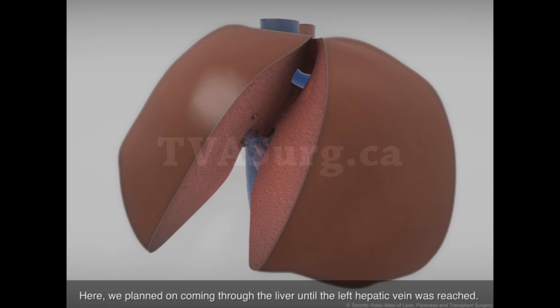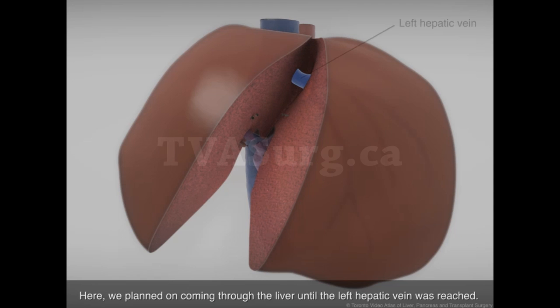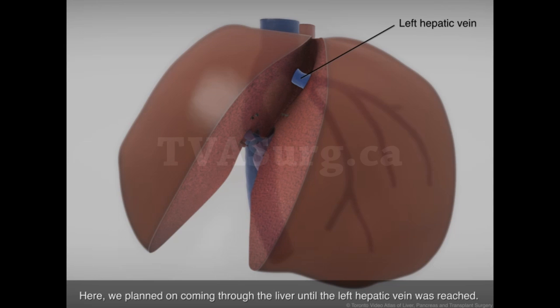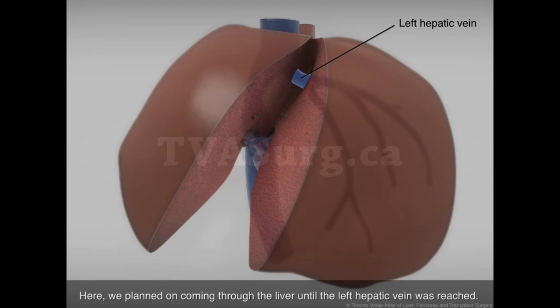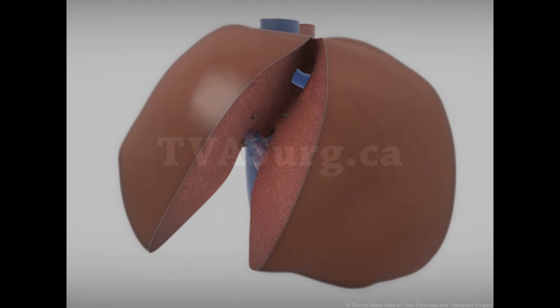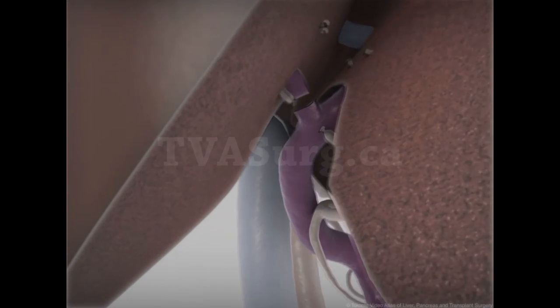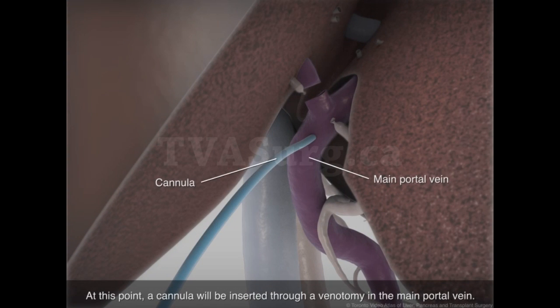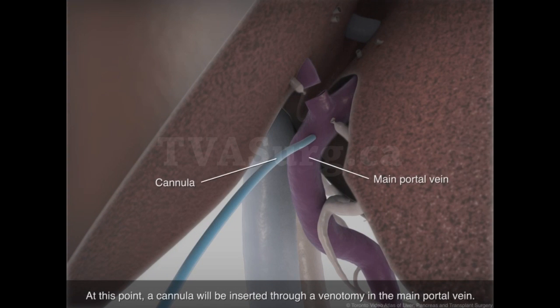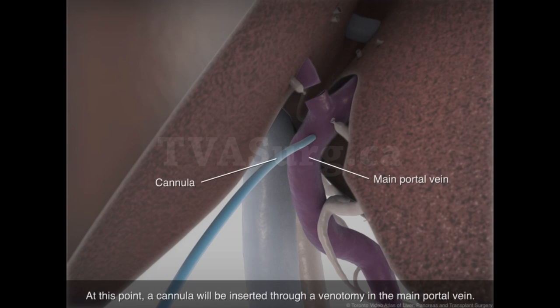Here, we planned on coming through the liver until the left hepatic vein was reached. At this point, a cannula will be inserted through a venotomy in the main portal vein.